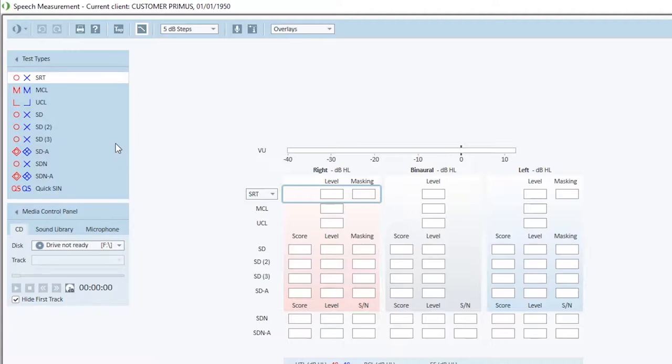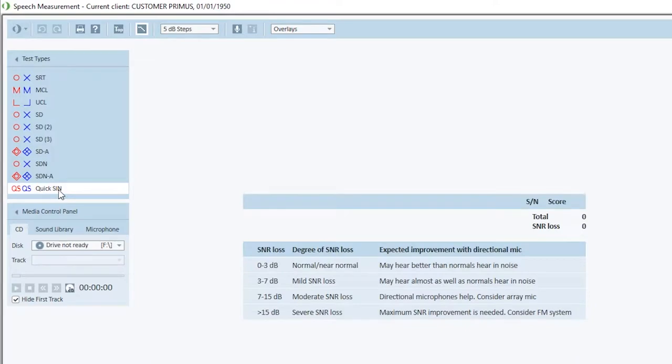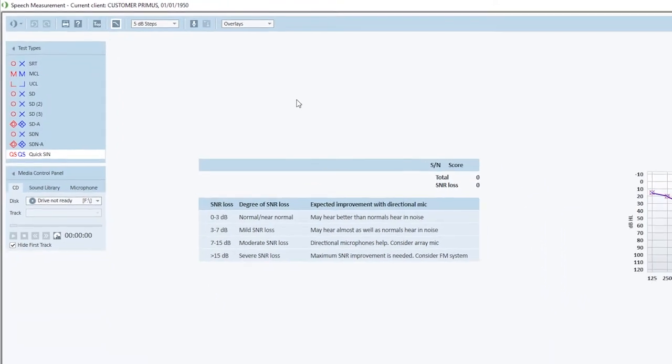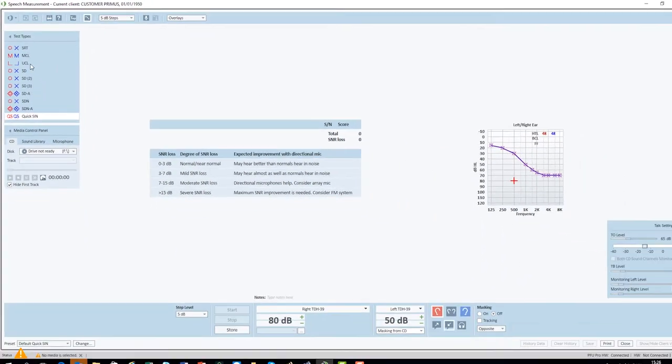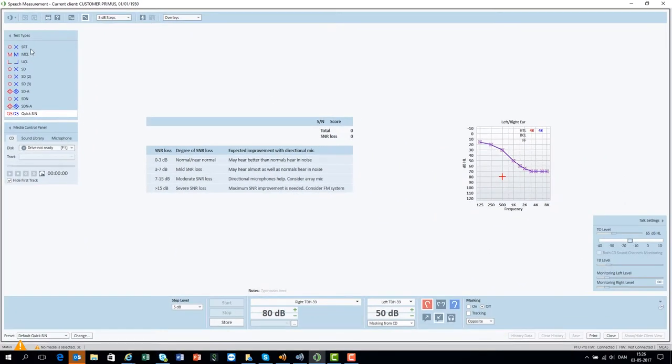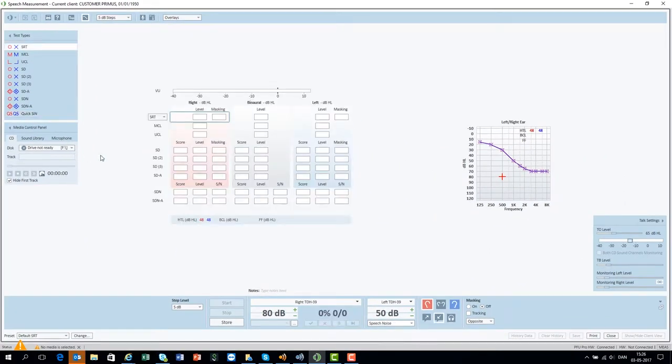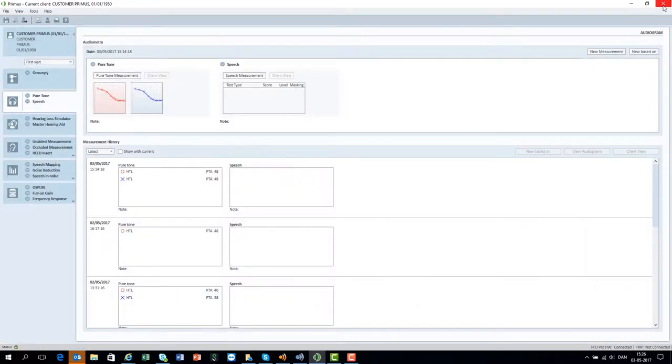Speech discrimination as well as several other speech audiometry tests are available. As in the other Primus modules, you can define the settings for each individual test type by choosing change.